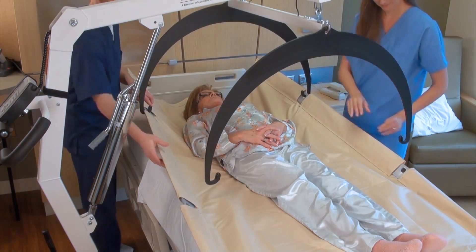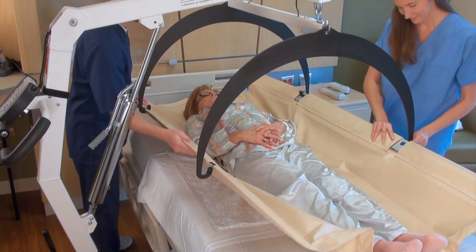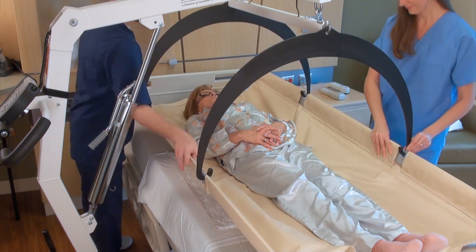Once more, connect the stretcher to the support hoops using the holes in the stretcher support bars on either side of the patient.